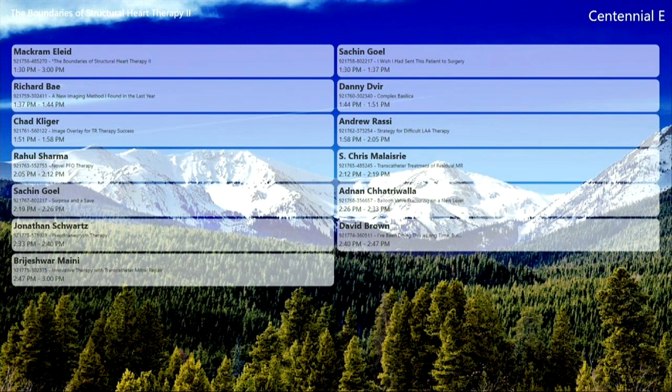Yes. You see these devices, so I think the value of the fusion technology, you see those devices on X-ray. So I think as you use the fusion, you can navigate around them just based on X-ray technology. I think it really adds value when there are things that you cannot see, so the fluoroscopically silent things. So looking at and directing towards the leaflets where you anchor for an annuloplasty device, this is where the true value of this is.